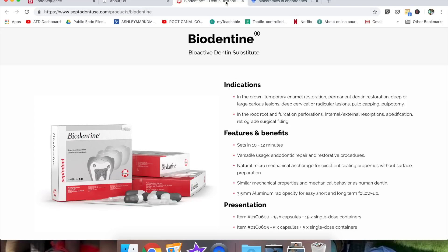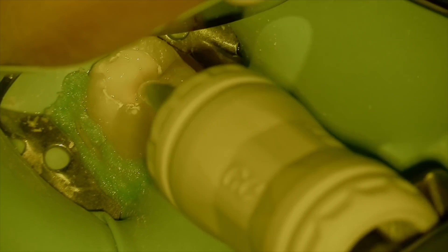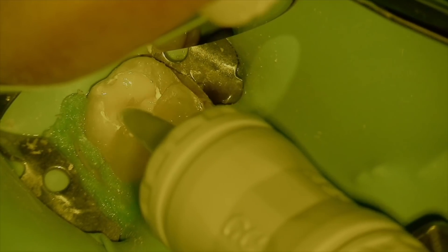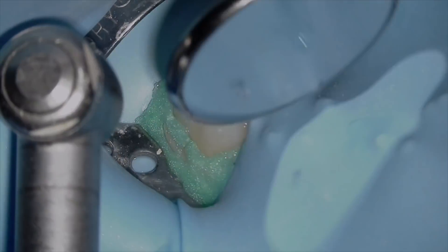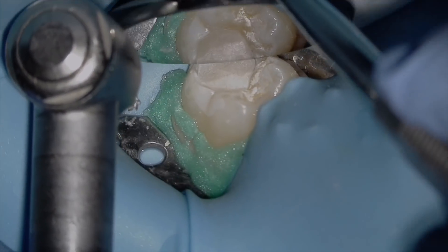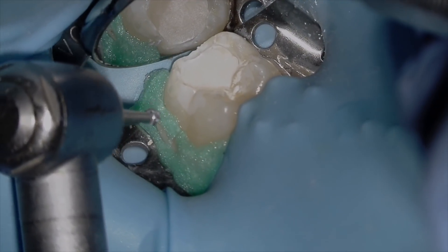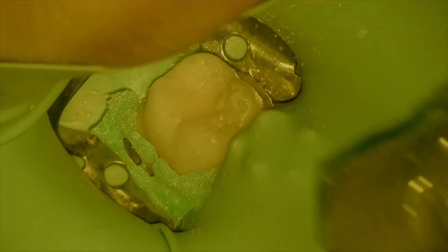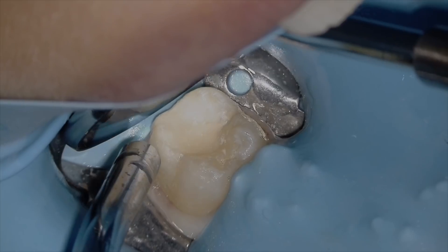Biodentine is another option I've not had any experience with, and the literature does note good outcomes with it as well. Materials will change throughout time and a quick Google Scholar review can help you decide what product to use for these types of procedures. Because this patient lives approximately an hour away, I elected to use a resin-modified glass ionomer such as Fuji 2 as a base and then cover it with a composite restoration. RMGI chemically bonds to tooth structure and I'm really looking to make a super seal to ensure no bacteria make their way into this healing pulp. And we're just finishing up the composite restoration — voila, we're done.